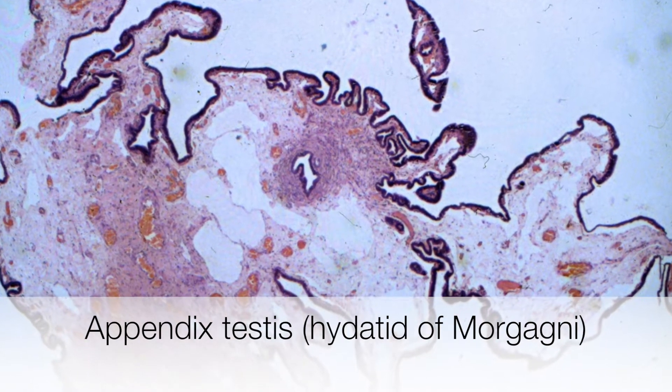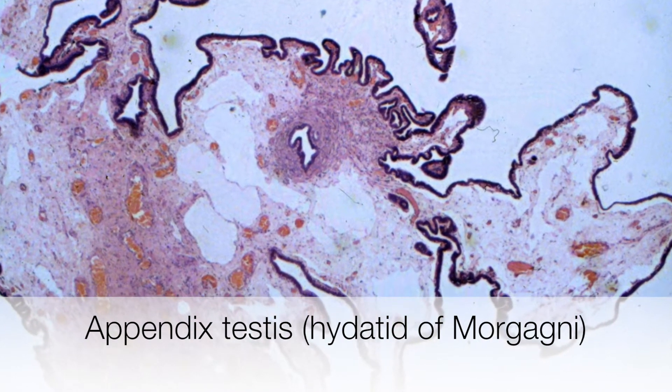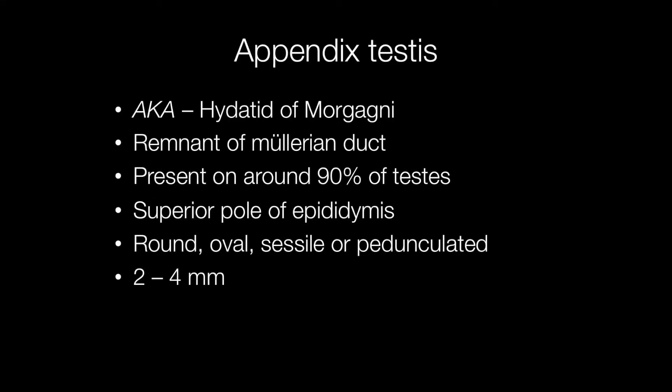This rather odd-looking structure is an appendix testis. An alternative term for appendix testis is hydatid of Morgagni. These are extremely common lesions and present on around 90% of testes at least. They are a remnant of the Müllerian duct and are situated at the superior pole of the epididymis.